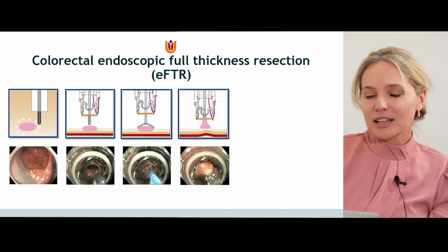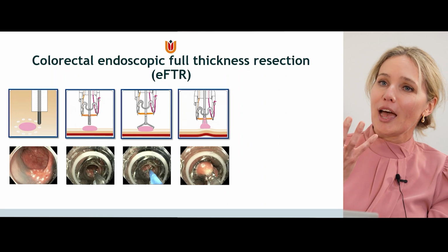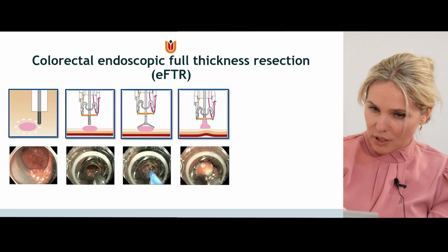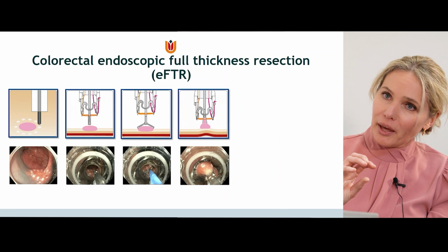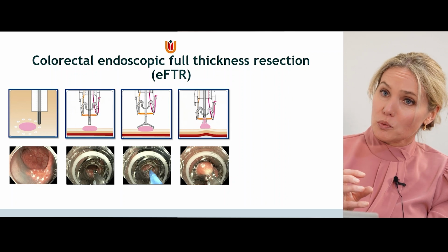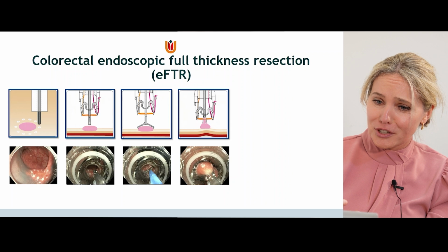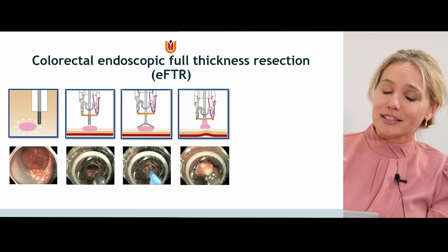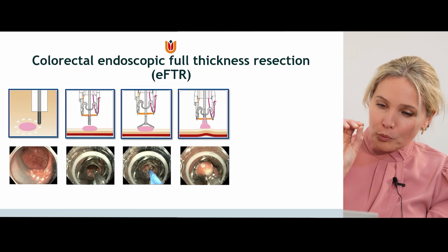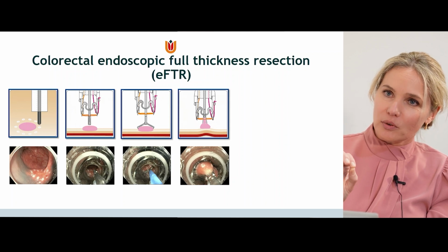Yeah, that's right. And then you have to be careful, because if you completely fill your cap and you don't see this white ring, which is very important, that you see that, because the tactile feedback of your clip being released is essential before you start cutting, of course. Otherwise, we have a 4 centimeter perforation. You wouldn't want that. So if you fill your cap completely with tissue with additional aspiration, you just push your tissue out a little bit with the grasper, so you can see the white ring.